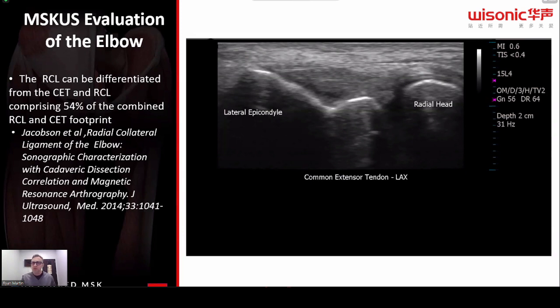Tease it out, do some contractions, do some resisted tests, but 50% of this slope is going to be common extensor. 50% of this slope is going to be more of your radial collateral ligament right here. The nice little pictures that we put in there with some arrows. And this one looks like it has maybe a small cleft in here, but I wouldn't know without testing it. And then over here, what you can see is part of that radial collateral ligament coming up over the radial head and attaching down through here.